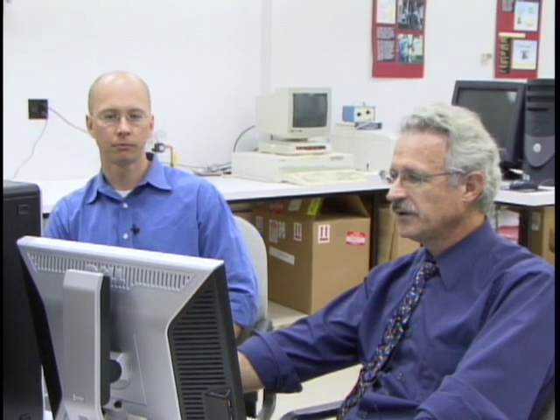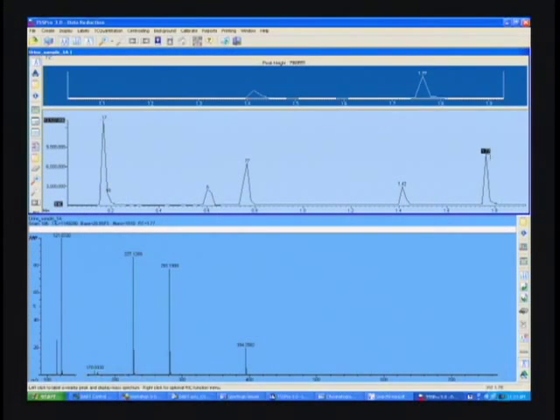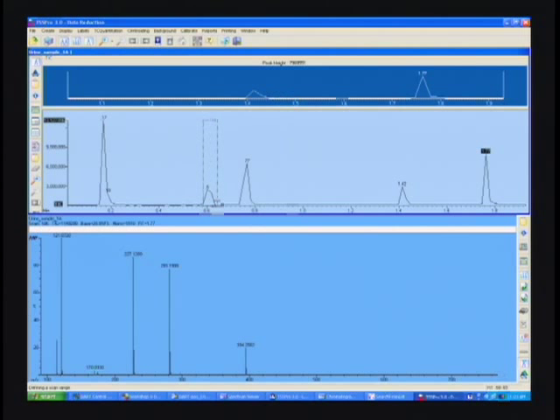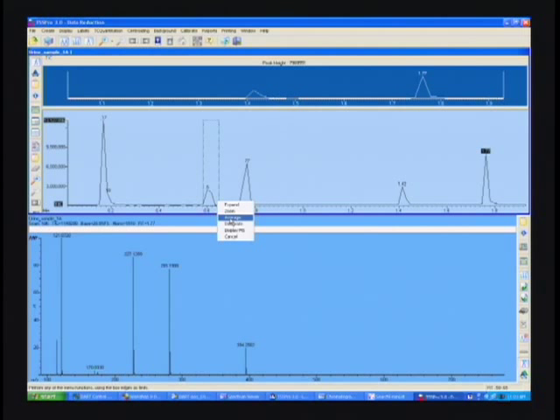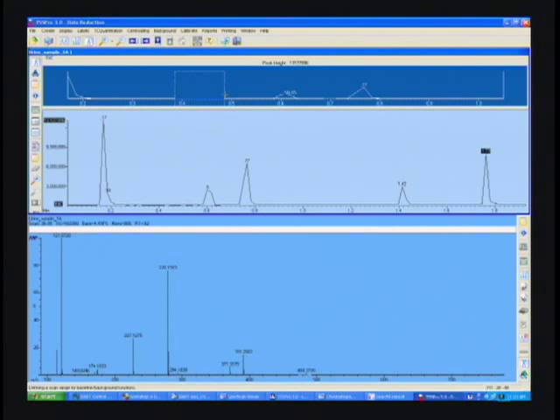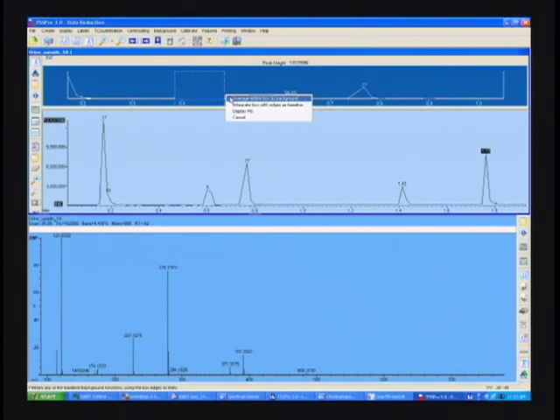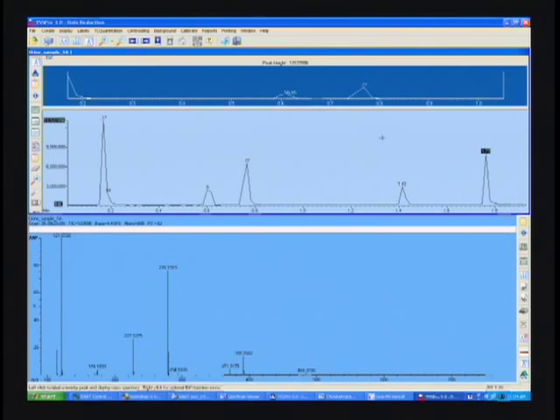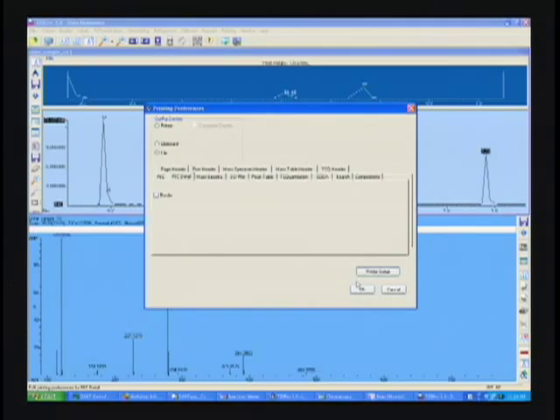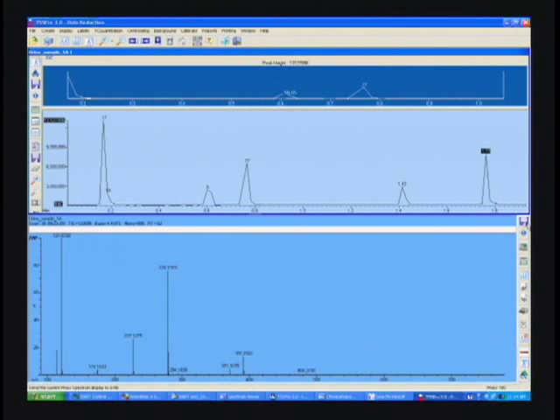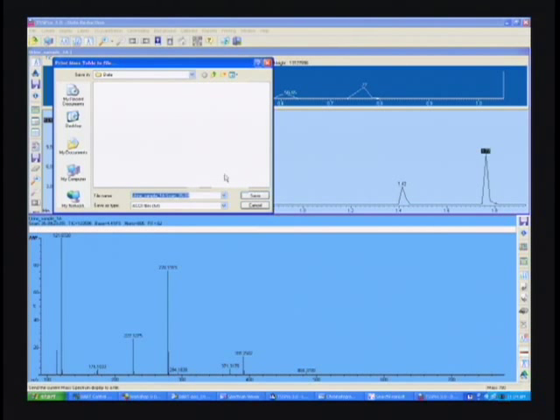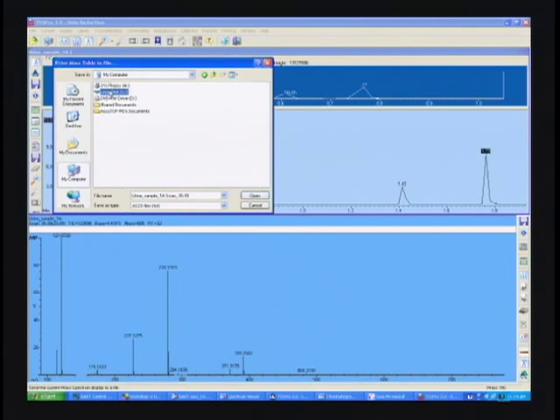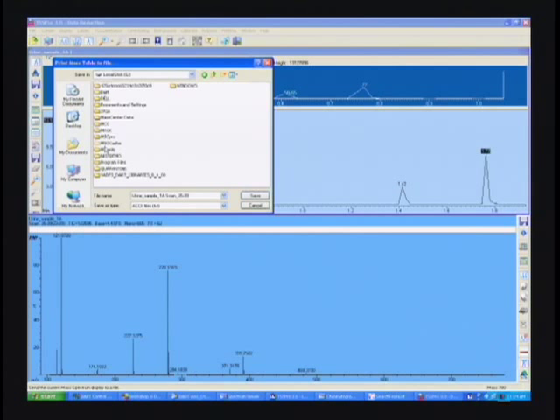You can see the total ion current trace shows where the urine was measured each time. This is the first one. Just average that whole thing. I'll do a manual background subtraction, but that can be programmed to be automatic. There's certainly something interesting there. Let's save that to a file. Let's hit the clipboard, save it to file in the same directory as everything else.